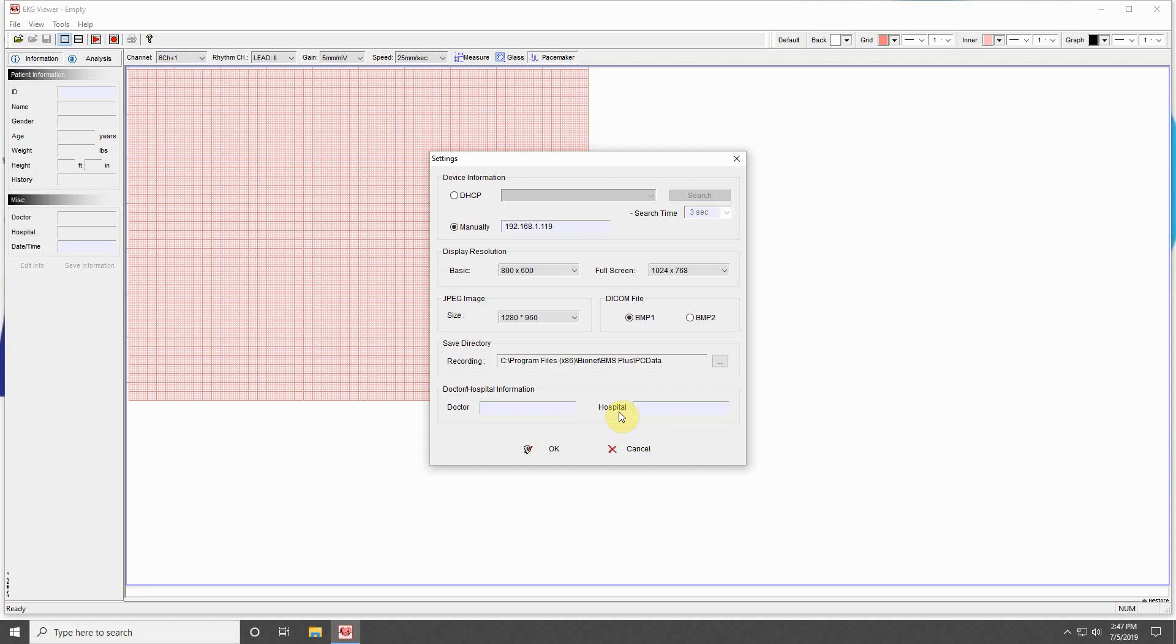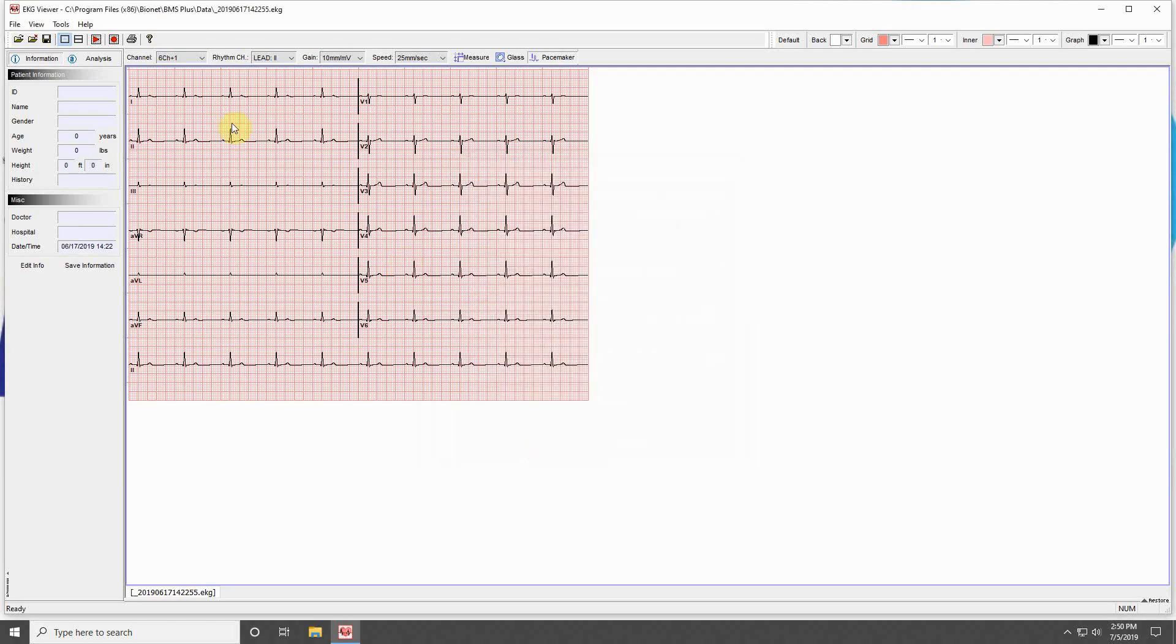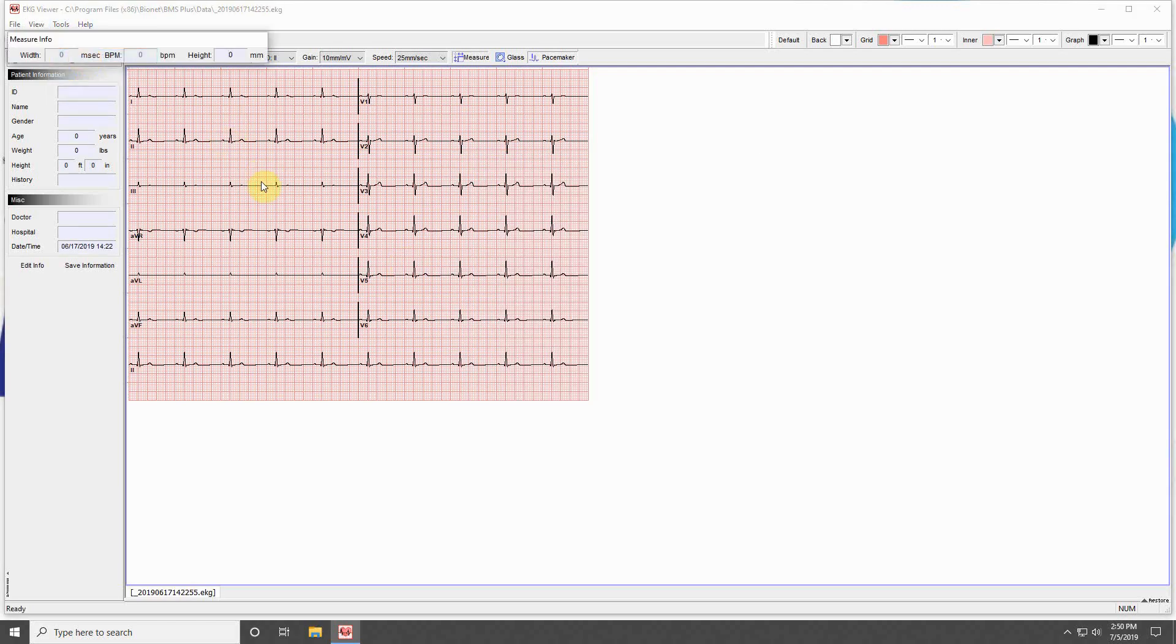Going back to the Tools menu, select Measurement to measure the ECG vertically or horizontally. You can exit the Measurement tool by clicking on the Measurement button over here.